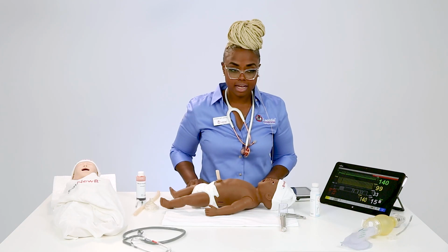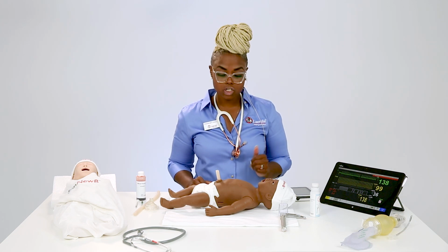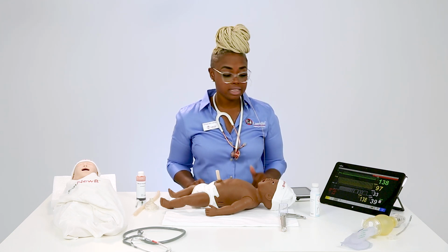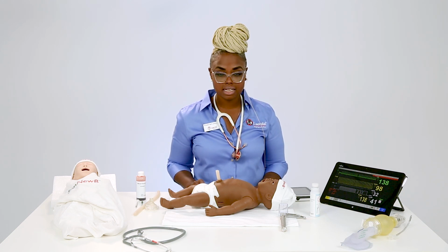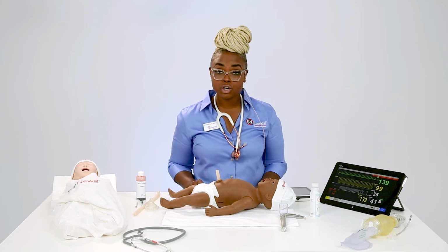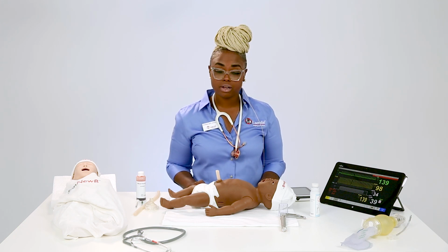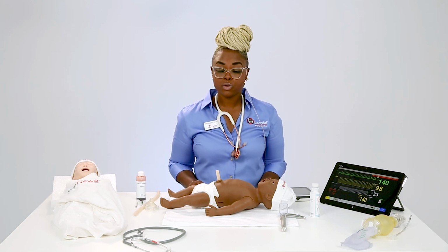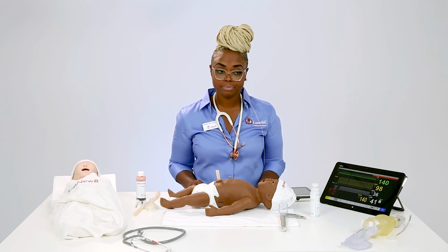Next, we will move on to breathing. SimNewB offers a multitude of breathing options. These include, as we just talked about, spontaneous or assisted respirations. You can simulate the O2 saturation here on your patient monitor, and that can be set at a variety of settings. Anytime that you take SimNewB's oxygen saturation below 88, he starts to become cyanotic around his mouth. And the further you drag that saturation down, the more illuminated that will become. Also, he has a unilateral thoracentesis site, which is mid-axillary, and you are able to decompress that.